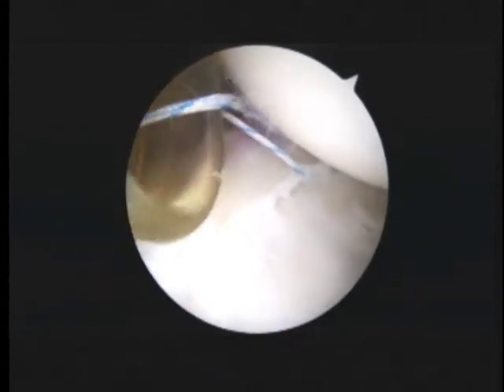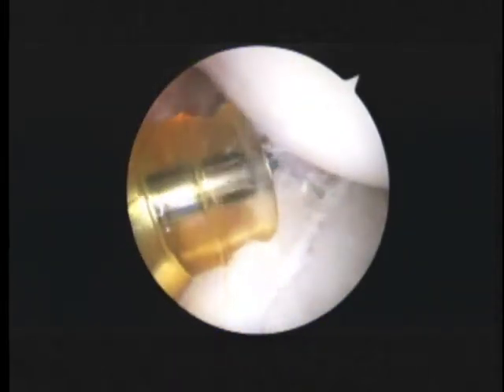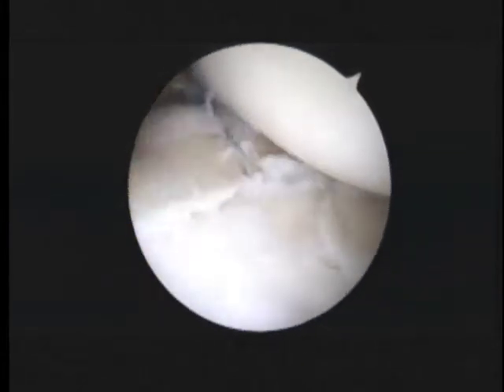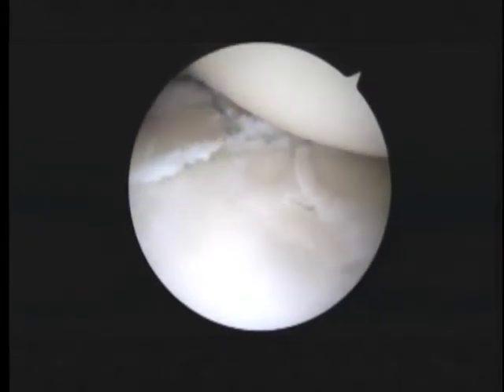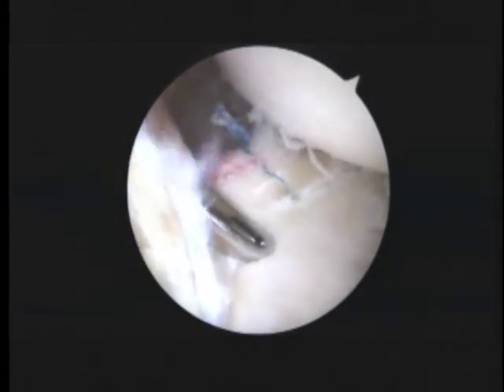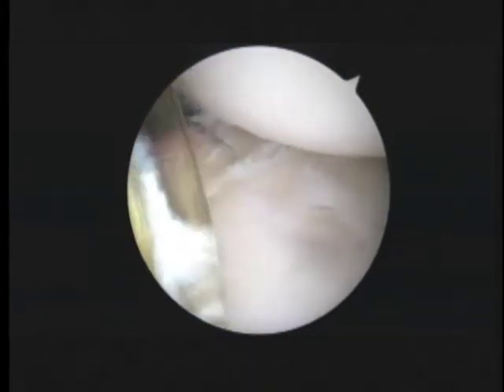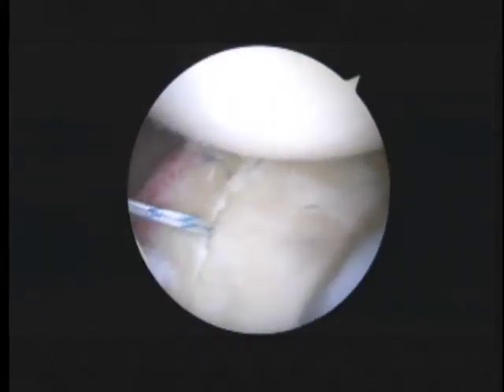We'll tie that down. We're just cutting the suture tails from the first knot here. And you can see what that's done — it's anchored down that labrum in the back right there. That looks good. We're placing a second anchor posteriorly because the labrum was still a little bit loose, a little bit too loose for my liking. So there's the second anchor, seated. Feels very solid. We'll take one of the sutures out through the yellow cannula.